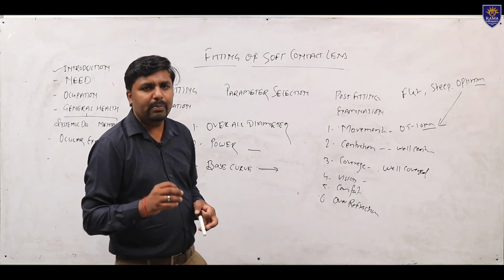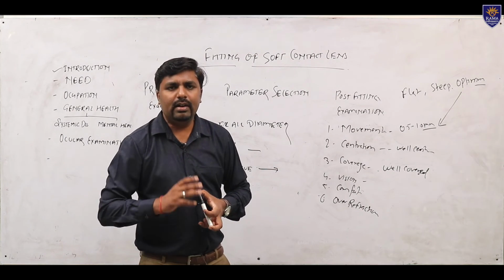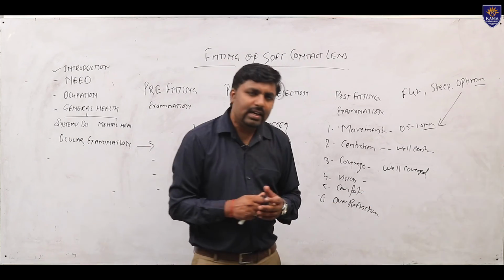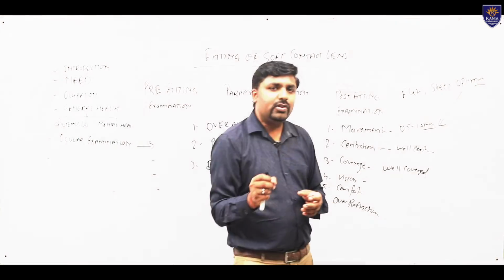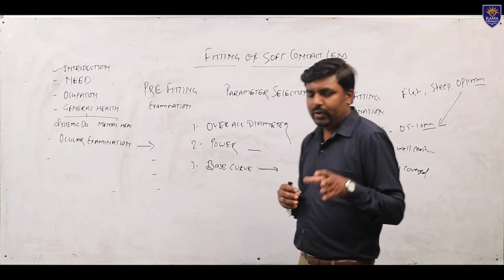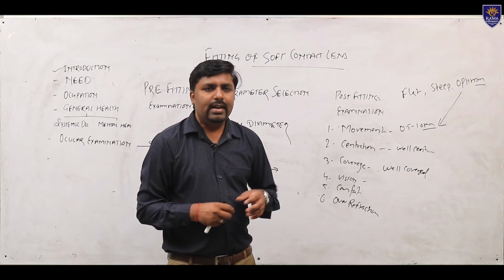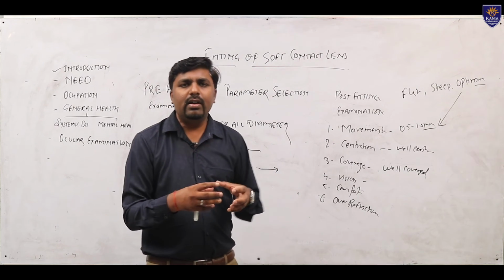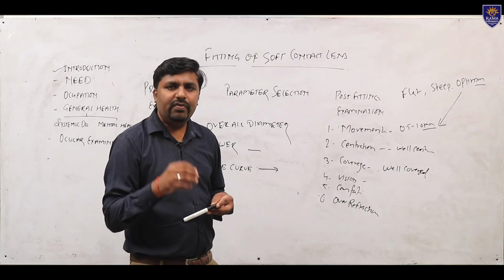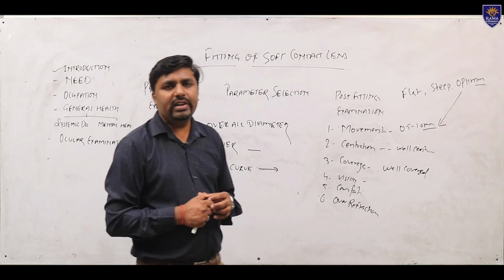If the patient is getting proper vision, that means we have succeeded in fitting the contact lenses. Next, comfort. Comfort is very important, and each and every time we should achieve this comfort level, because contact lenses are going to be used all day, the full day. So, the patient should be comfortable with the contact lenses, and then we do the over refraction.